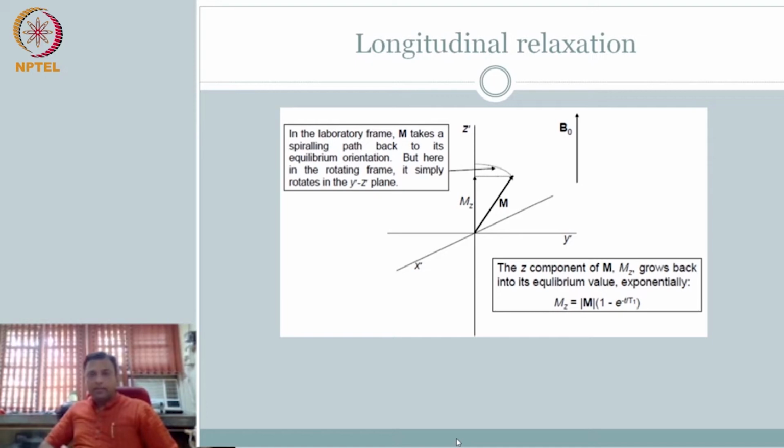And the reason for that is we are just going to complete one important concept that is related to the T1 and T2, T2 star that we were talking about, and to do with recording the signal, right? Your decay signal in relation to application of excitation pulse.